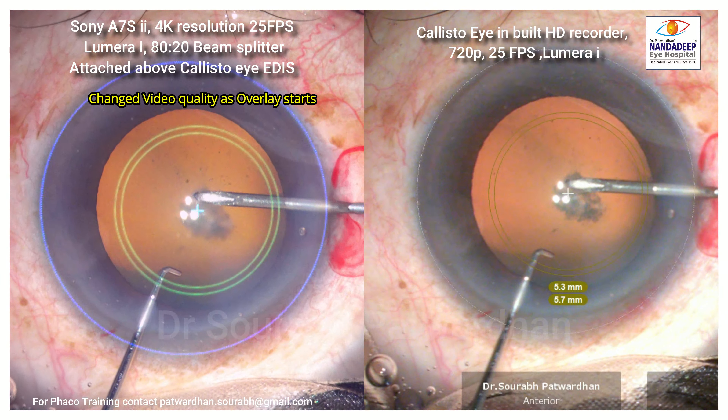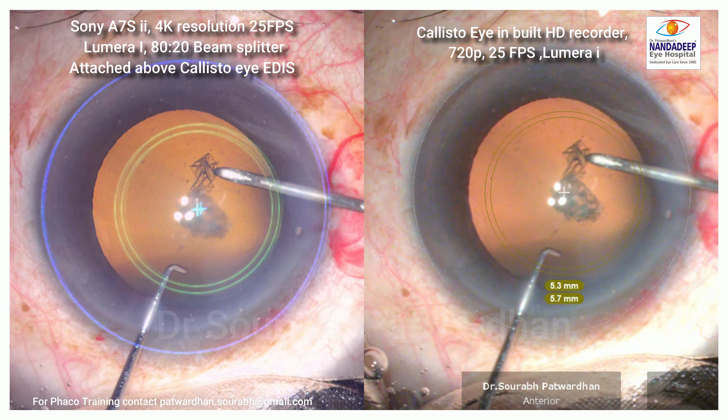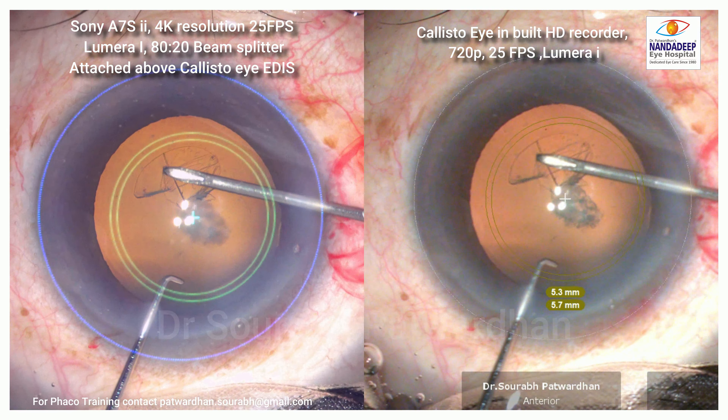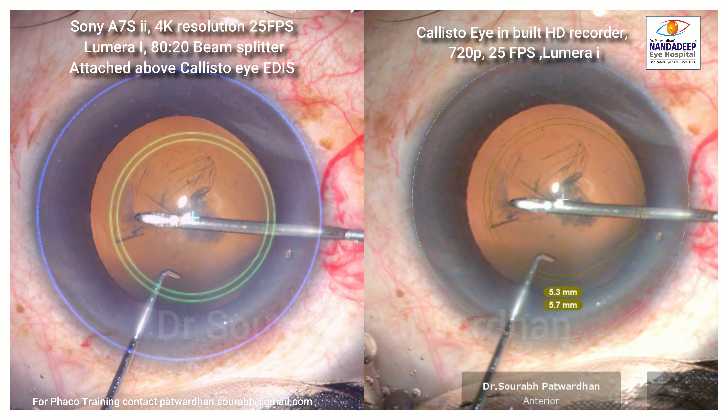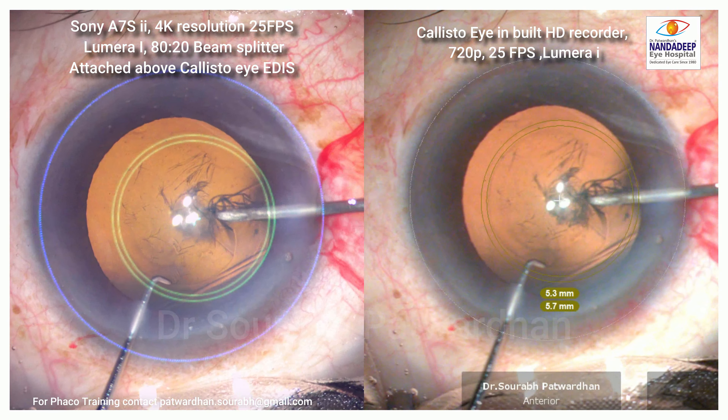You can see a bluish tinge on the left side, because the overlay is now active in between. What the Sony A7S2 is recording on the left is exactly what the surgeon sees. You can also see some latency — a difference between the eye movement and the movement of the overlay which the surgeon sees.